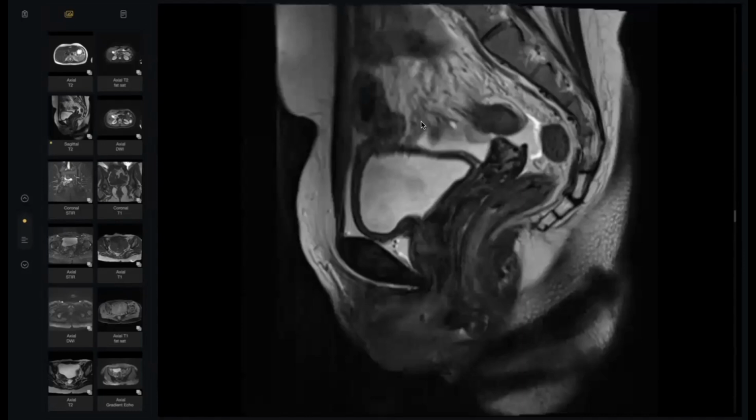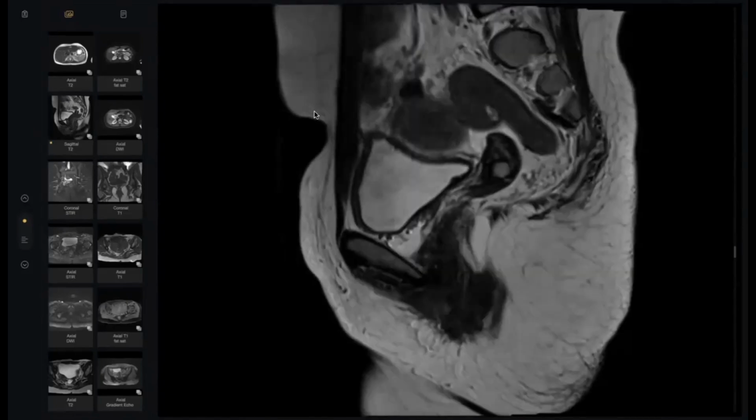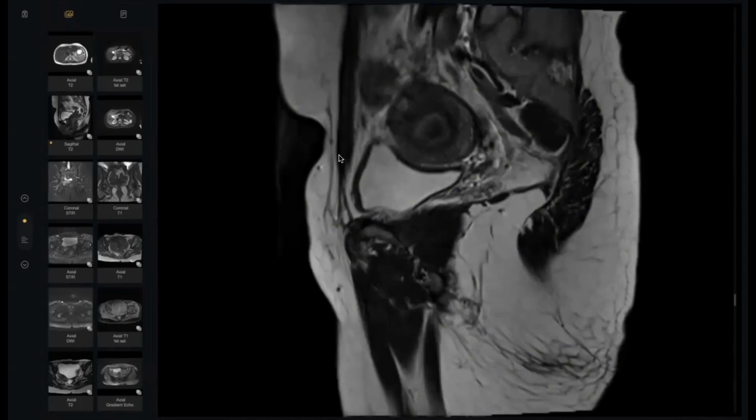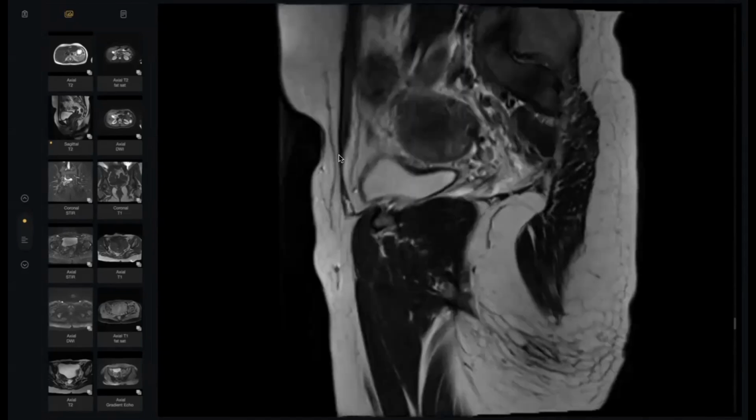Doctor, you talk about two uteri and one cervix, correct? Yes, sir. So give me first, what's your concern? Sir, my concern is that it can be uterus didelphys or bicornuate uterus. And secondly, I would also like to see the kidneys once again. You told me you found one cervix. So it can be bicornuate unicollis. Okay, you are on the correct pathway. And what else? Compare both uterine cavities with each other. Are they similar?